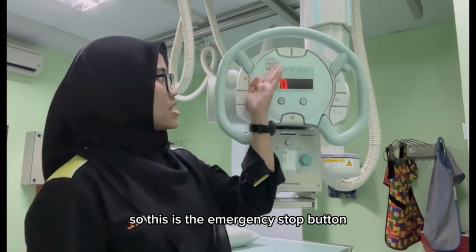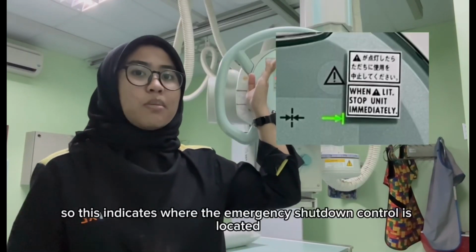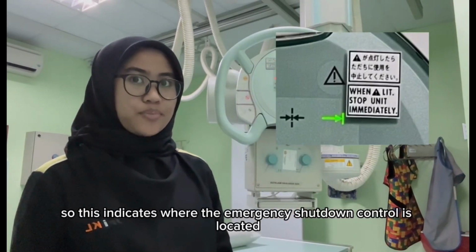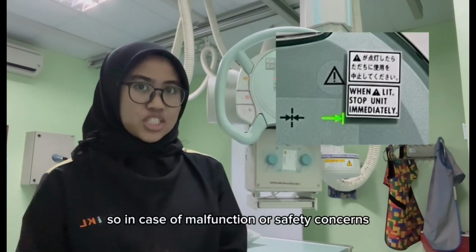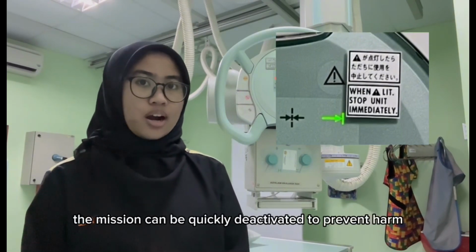This is the emergency stop button. This indicates where the emergency shutdown control is located. In case of malfunction or safety concerns, the machine can be quickly deactivated to prevent harm.